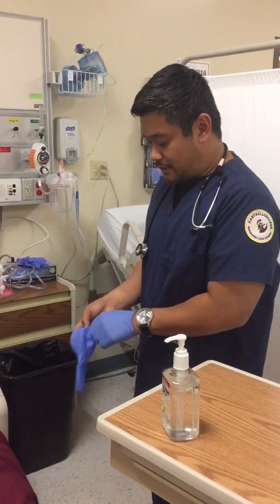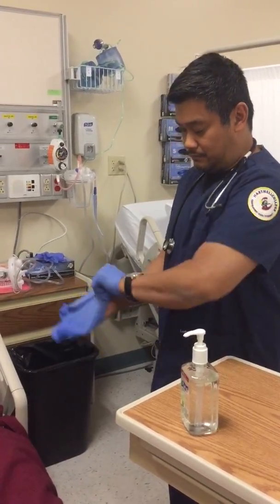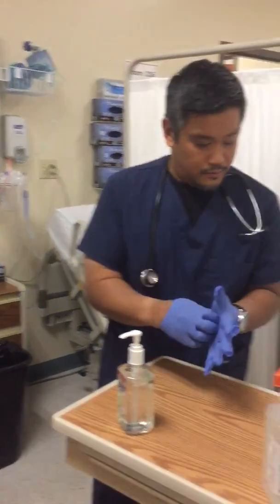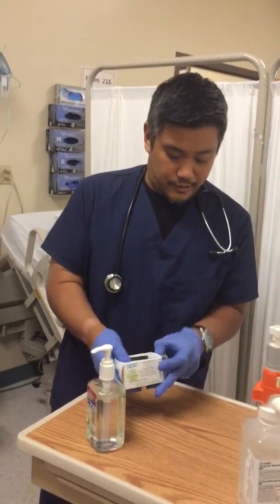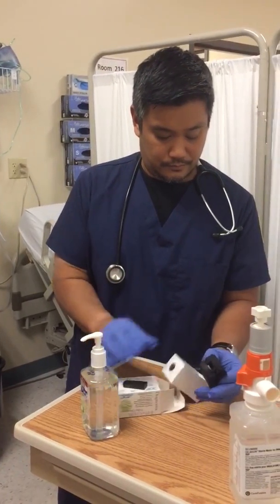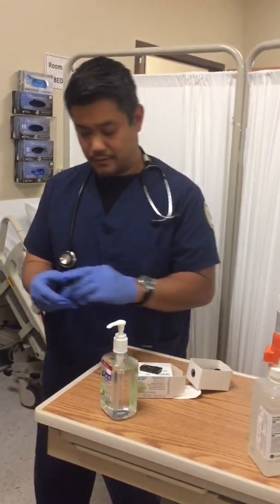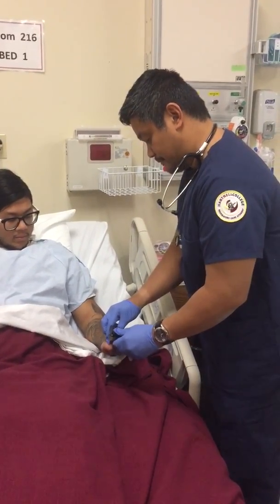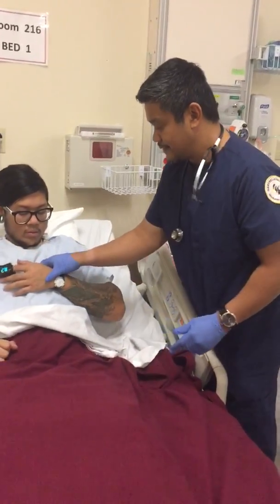All right, we'll be starting off by taking your vitals. We'll be doing your oxygen saturation. Let's go ahead and put this on your index finger. All right, let's put this against your chest.